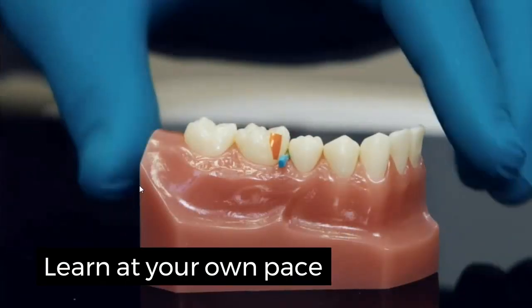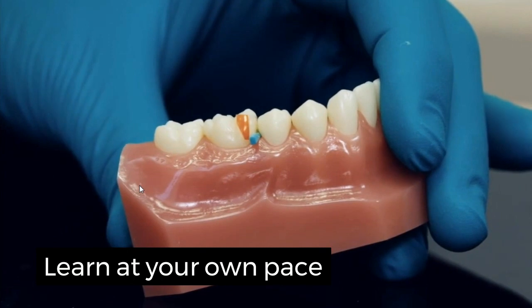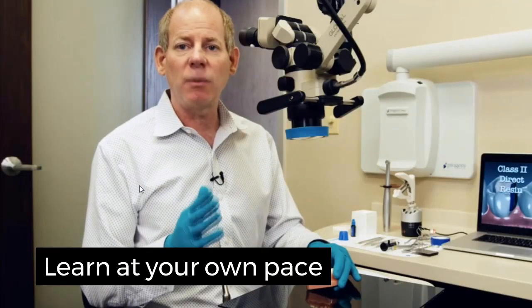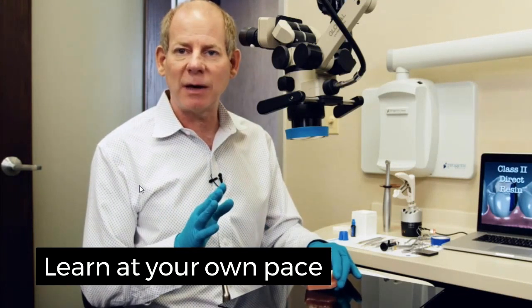Now, commonly in the mouth, if I find that this matrix band is in my way for instrumentation, then I will take out the matrix band but leave in the wedge. I don't want to take out the wedge because then the gum tissue is going to start bleeding. In this case, the matrix band's not in my way. I'm going to just leave the matrix band as it is.